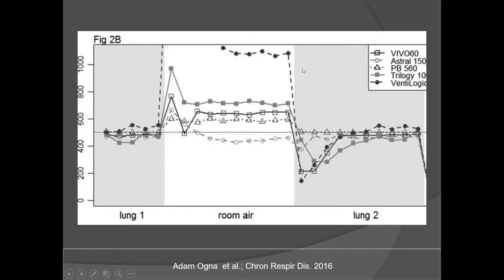So it is better to set a higher volume, for instance, 1,000 or 1,500 milliliters, because you know that it will take time to give the right volume after reconnection. So in real life, patients are always using the mouthpiece in these circumstances. So it's quite normal to set an initial higher tidal volume.